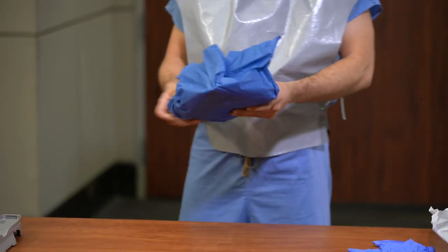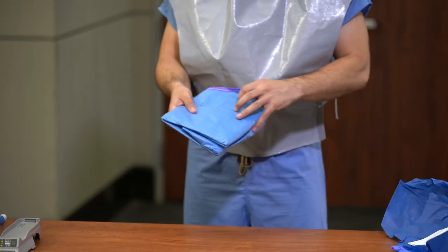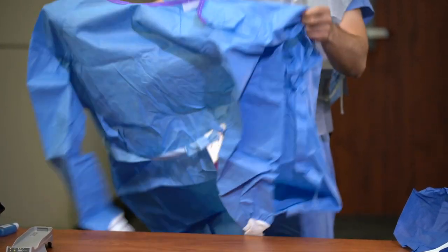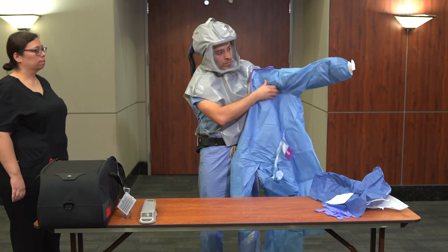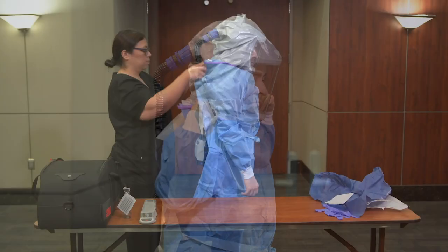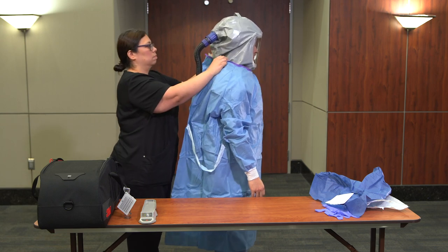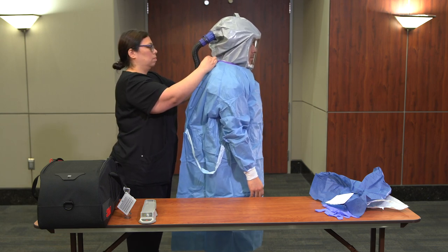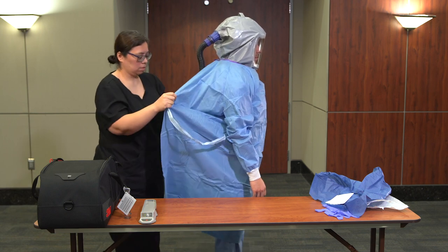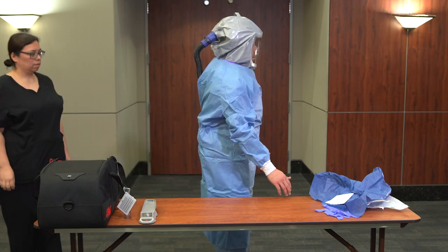Don the surgical or reusable gown. If the procedure you are performing requires a sterile field, don according to protocol. The buddy should fasten the gown in a manner that allows the air hose to move freely. The gown should fully cover the torso from neck to knees, arms to end of wrist, and wrap around the back.